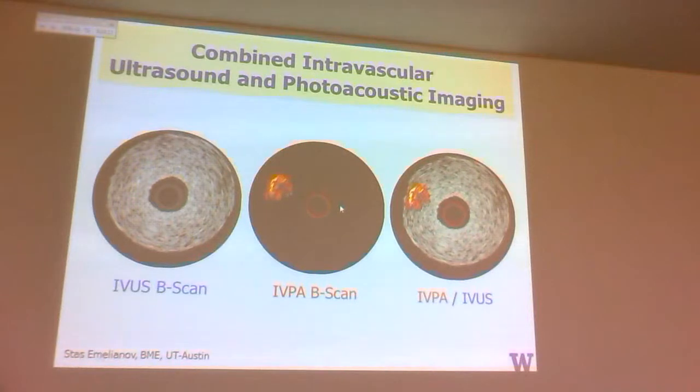intravascular photoacoustics. So this is intravascular imaging, just like I talked about earlier, where you bring an ultrasound transducer in, so you're imaging from the inside out. This is a very active clinical area in interventional cardiology, about 1 million of these procedures per year, so it's fairly routine. What they were doing is integrating in a system of that type. So some fibers, suboptimal light delivery, low repetition rates, but getting some photoacoustic information from within the vessel, and then making an integrated image.